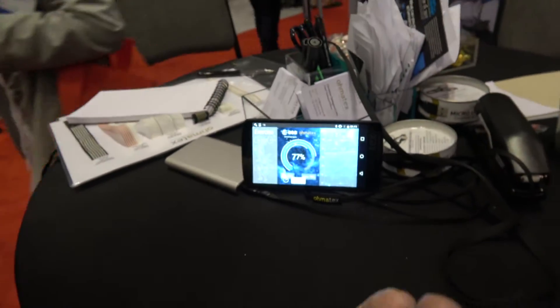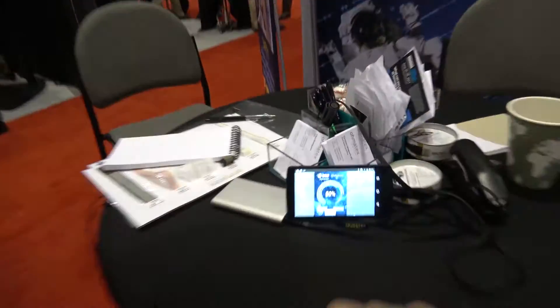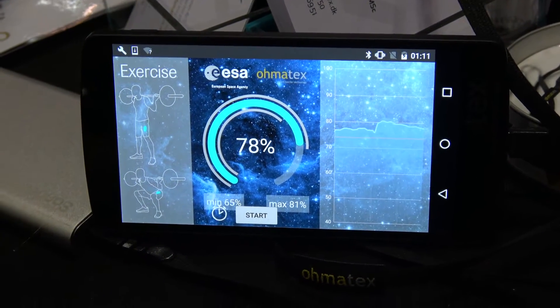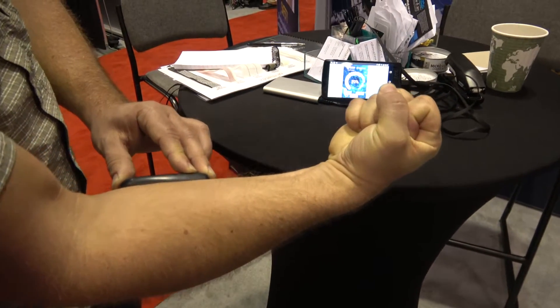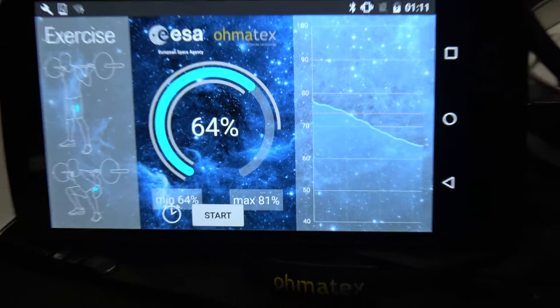So if I try to tighten the muscle and keep it tightened, you'll be able to see the curve starting to go down. You can see now it comes down very fast — it just drops and drops.